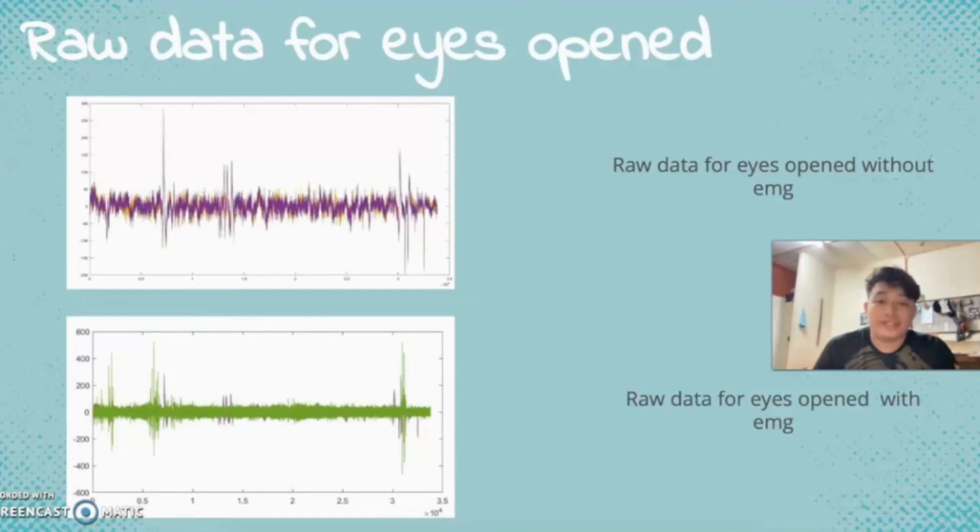For figure 8, the artifacts may come from the EEG machine, which can also be called instrument artifacts. The artifacts may also come from the stimulation of the brain due to stimuli seen by the subject in the experiment room, such as distraction from a moving clock, or movement from the other group members.